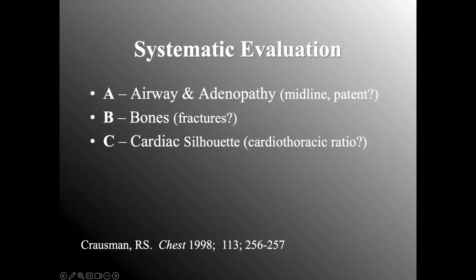Now, there's another thing to keep in mind, whether the film was taken at full inspiration or more close to expiration, and we don't always have that luxury of being present when the film is shot. Now, I know in the neonatal intensive care, sure, you're there, you're helping position the patient, but in the adult population, one of the first things they do is make sure you've exited the room and you hear that famous shooting x-rays, and there they go hitting the button.